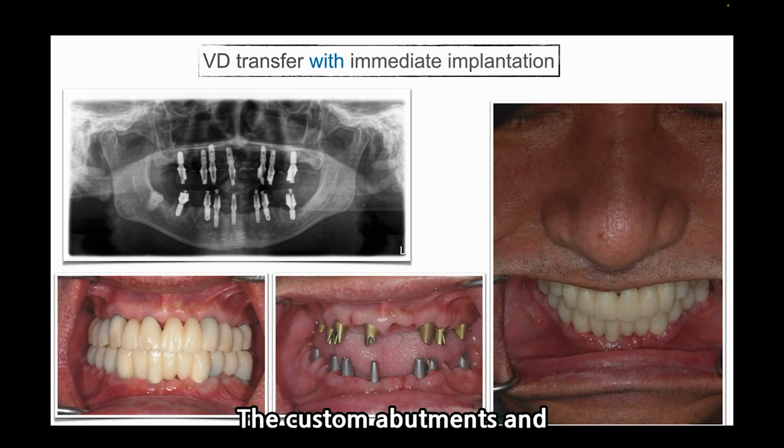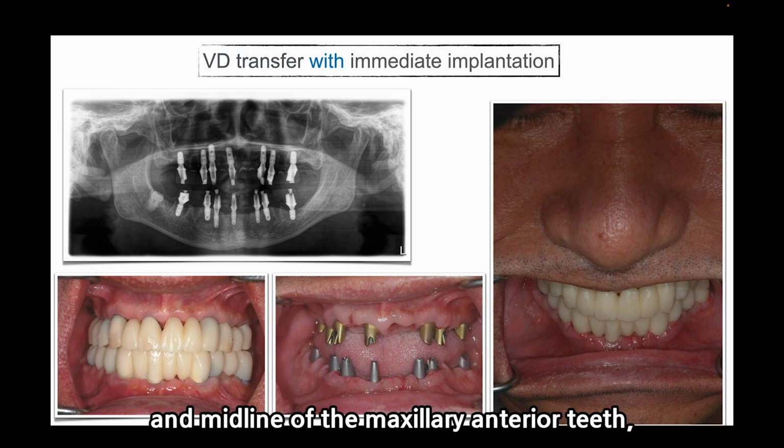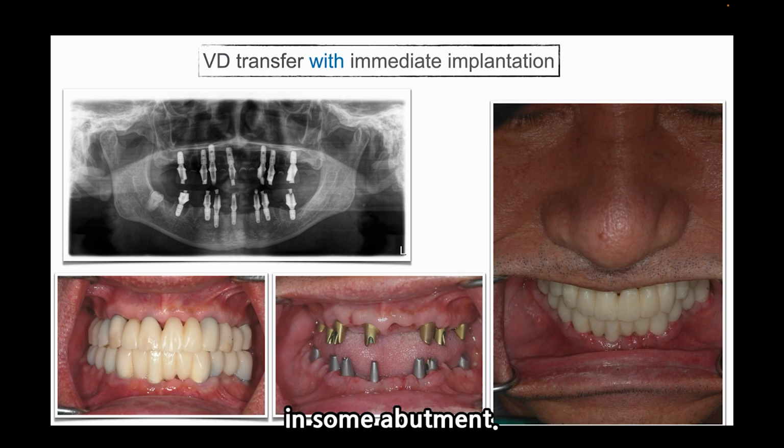The custom abutment and PMMA temporary prosthetics were installed the day after surgery. Considering the existing occlusal plane and midline of the maxillary anterior teeth, patient discomfort was minimized. As seen in the photo, the dark color of the abutment is visible in some abutments.